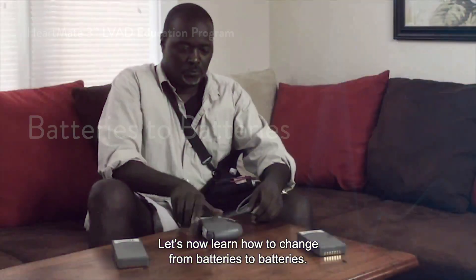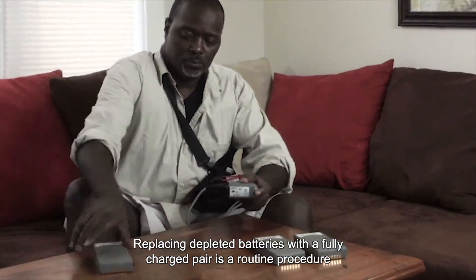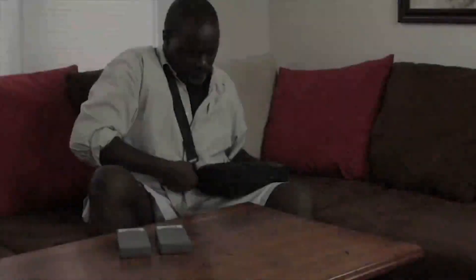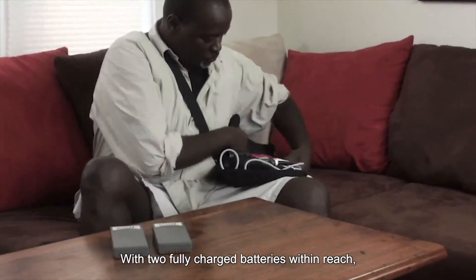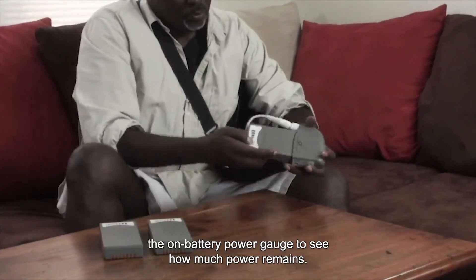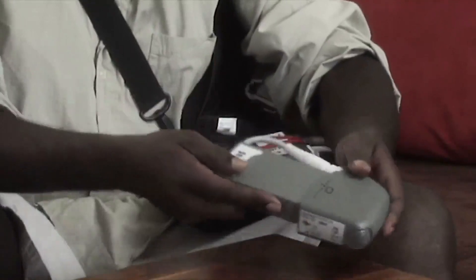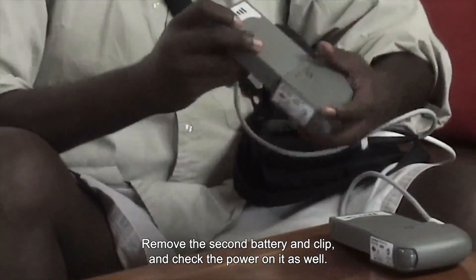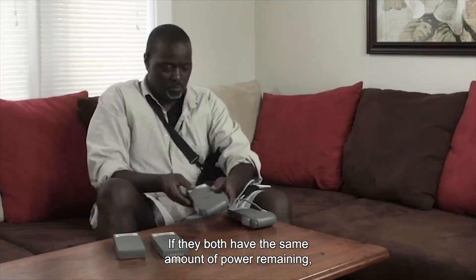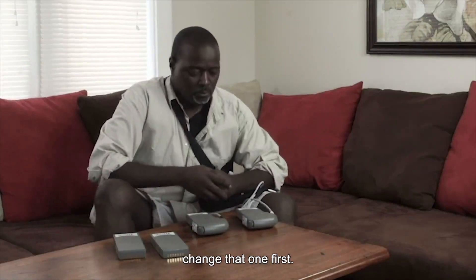Let's now learn how to change from batteries to batteries. Replacing depleted batteries with a fully charged pair is a routine procedure when you're operating on battery power. With two fully charged batteries within reach, remove a battery and clip from your GoGear wearable accessory and check the on-battery power gauge to see how much power remains. Remove the second battery and clip and check the power on it as well. If they both have the same amount of power remaining, you may switch either battery. However, if one has less power, change that one first.